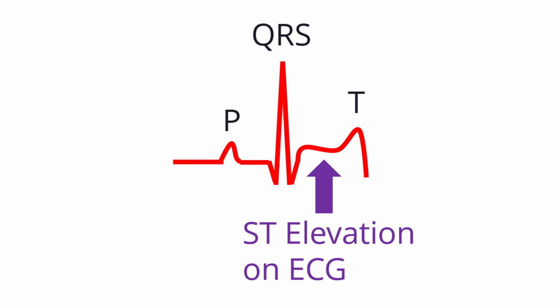A major ST segment elevation is an important sign of ST elevation myocardial infarction, STEMI, which is a major heart attack due to blockage of a blood vessel supplying the heart muscle. This finding has to be supported by symptoms, mainly chest pain, and elevation of cardiac troponins in a blood test.